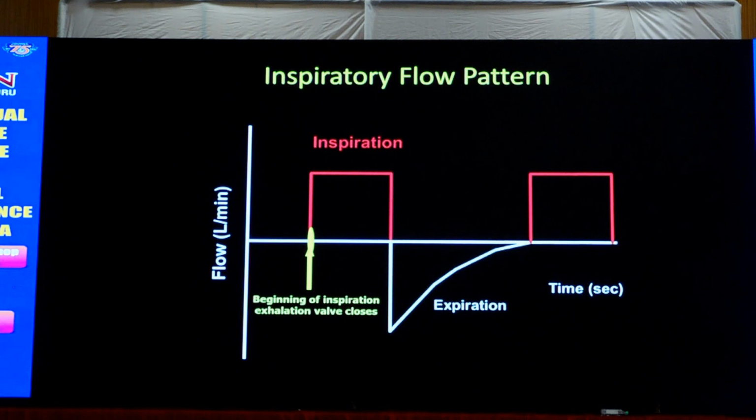And when I talk of scalars, what you have to understand is, when we are talking of flow, it will not be pressure or volume, it has to be flow. This is the peak inspiratory flow. So when you are talking of a flow scalar, everything is flow. And this is the time, inspiratory time. On the time scale, you should look at inspiratory time, expiratory time, cycle time. On this scale it is always flow, and on this scale it is always time.